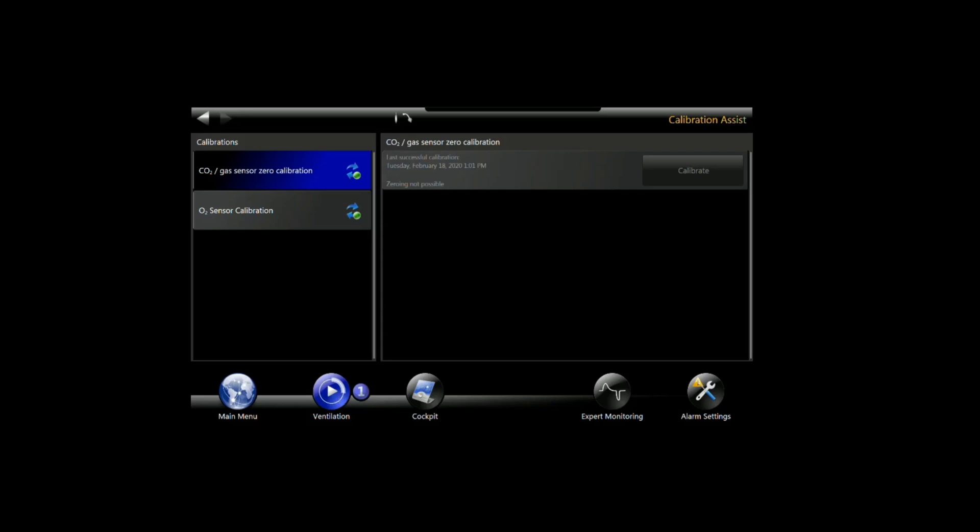If you do need to zero it, you want to have the sensor out of line. You can't do this with it in the patient. We're using the mainstream sensor today. Make sure that it's not anywhere near an exhaled gas source. You don't want any carbon dioxide in it. The manual will actually tell you to wave it around a little bit in the air. That's assuming that you've just taken it out of the patient's airway.